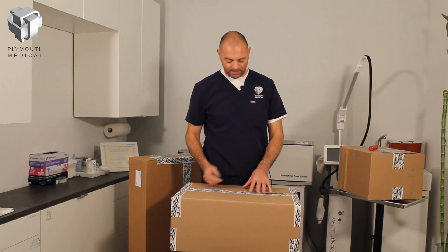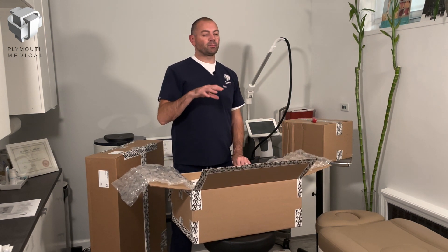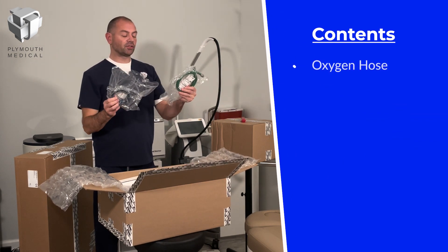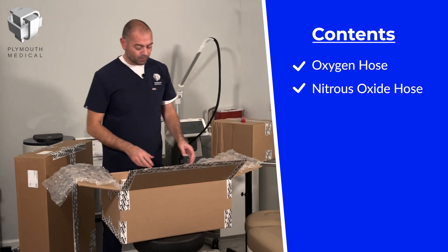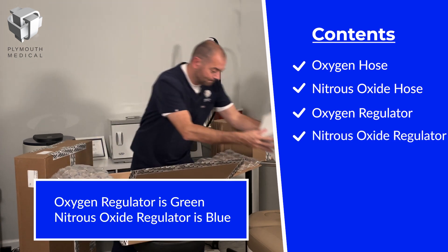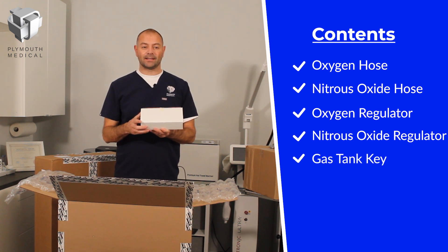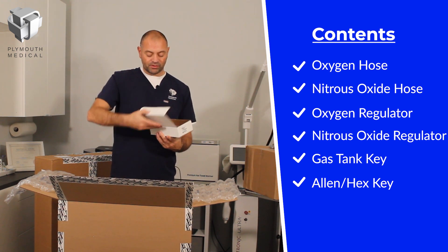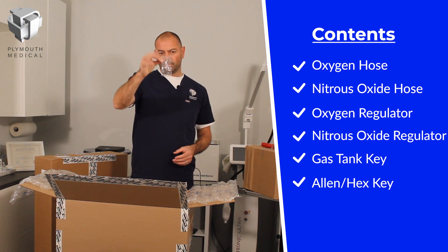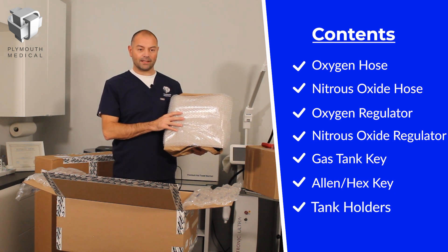Let's take a box cutter to the tape and open up the accessories box. There's a lot in here we won't need right away, so let me identify the key components. Loose in the box are the oxygen and nitrous hoses — we don't need those yet. There are also two regulators in separate boxes, which can go aside. In the smaller box you'll find the head mounting adapter with corresponding screws, the key for the gas tanks, and the hex key or Allen wrench, which we'll need shortly. Also in this box are the tank holders, which will be mounted onto the stand.